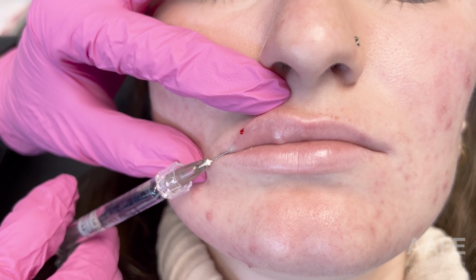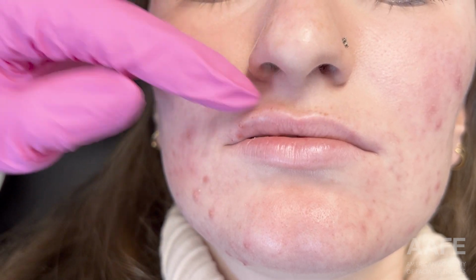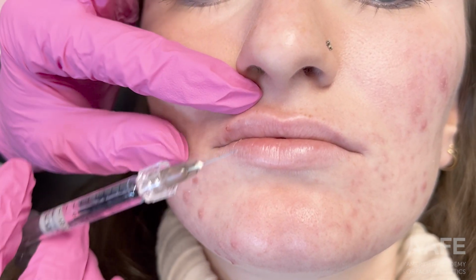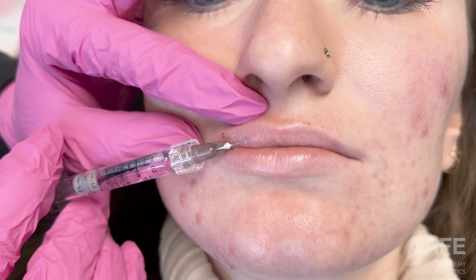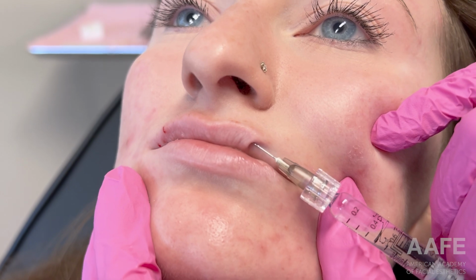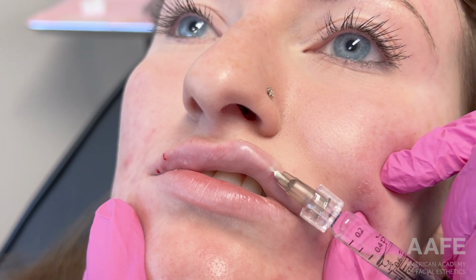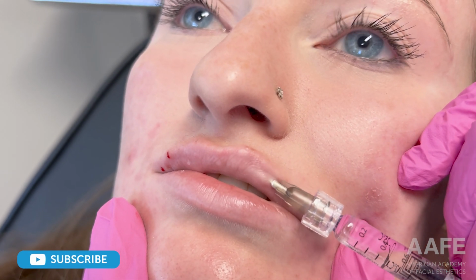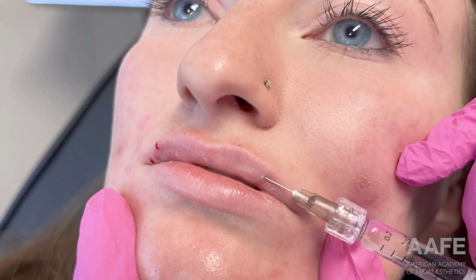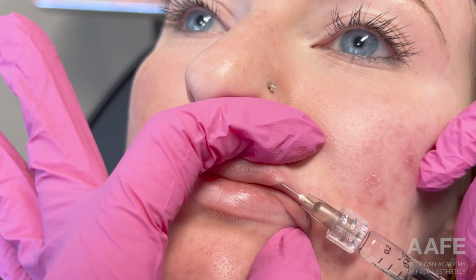I'm using the needle that the syringe came with in this case, and just applying some of that product right into the lip, placing nice linear struts of product using what we call standard volume technique. We have a million different fancy techniques that we can use to enhance and change a patient's lip size and shape, but in this case she has really beautiful lips to start, and she has the shape that we want and that she desires. We just want to add a little bit of volume.